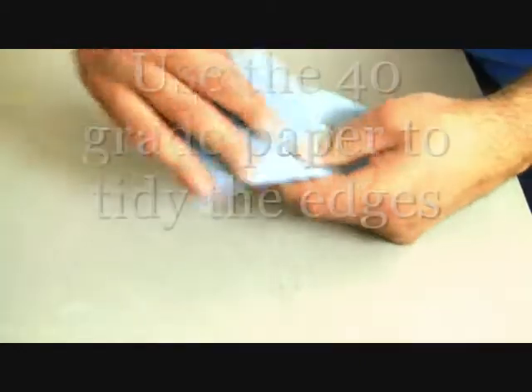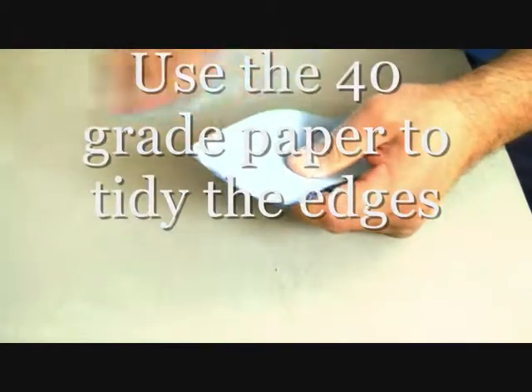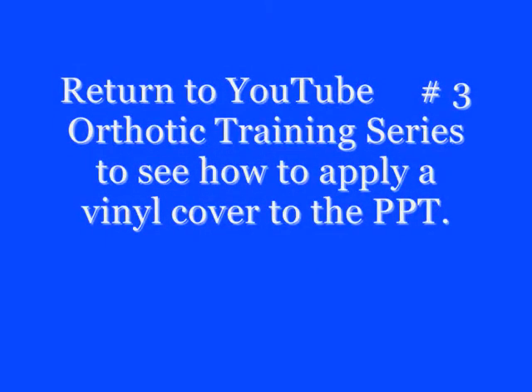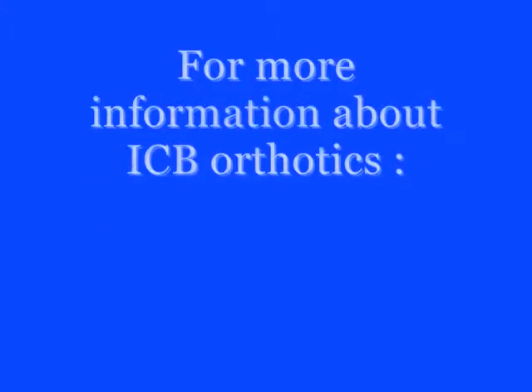The last step is to use the 40 grade paper to smooth off and tidy up the edges of the orthotic. Number 3 in the Orthotic Training Series is how to apply the vinyl cover to the PPT on an ICB orthotic.